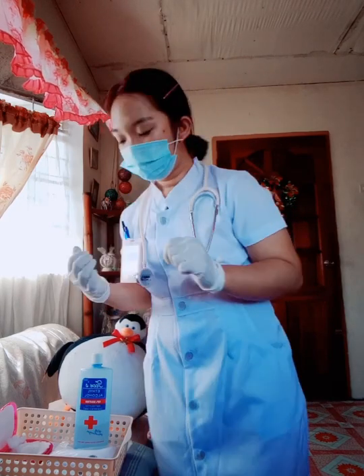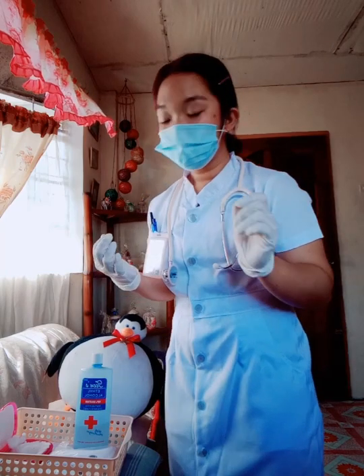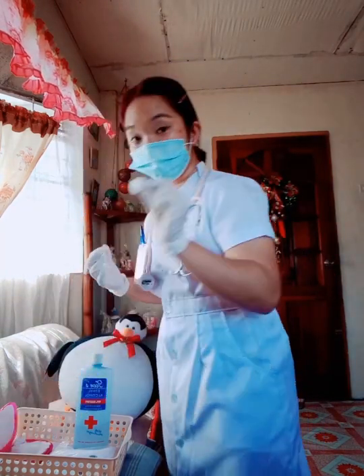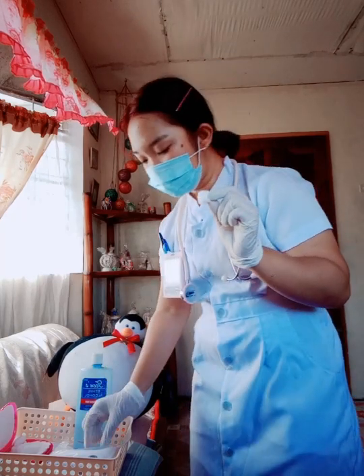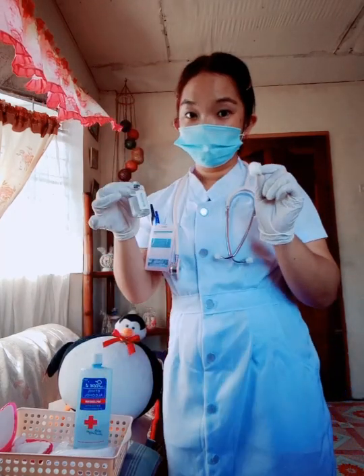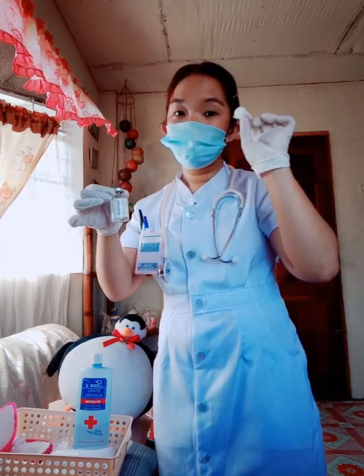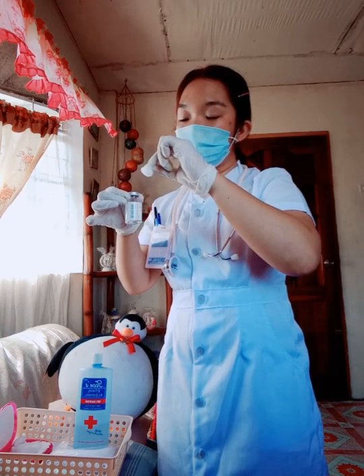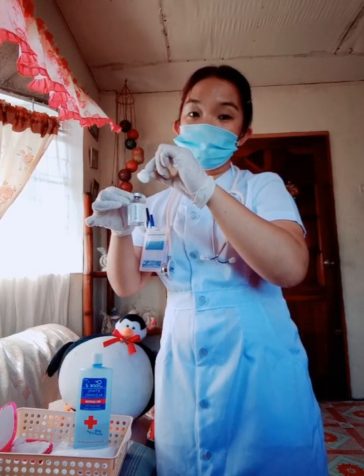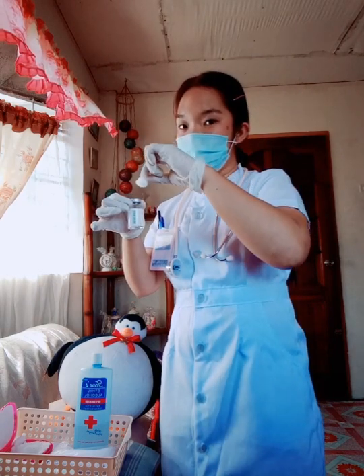So in this step, we can get a clean, sterile cotton swab, then grab the ampule or vial by the neck, which is the medication. Then, using the clean, sterile cotton swab, swipe it on the head of the medication in a circular motion for a second, like this.